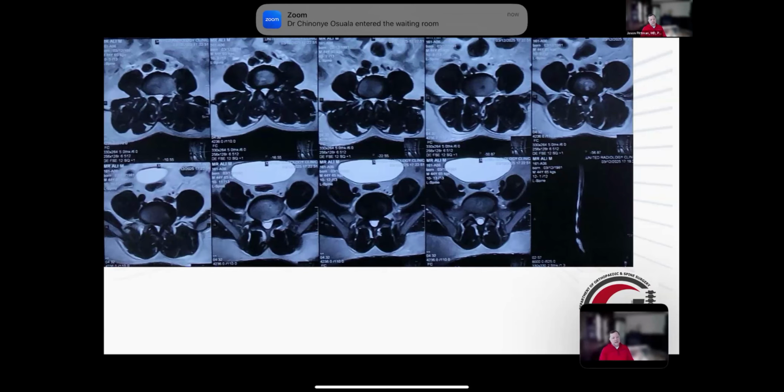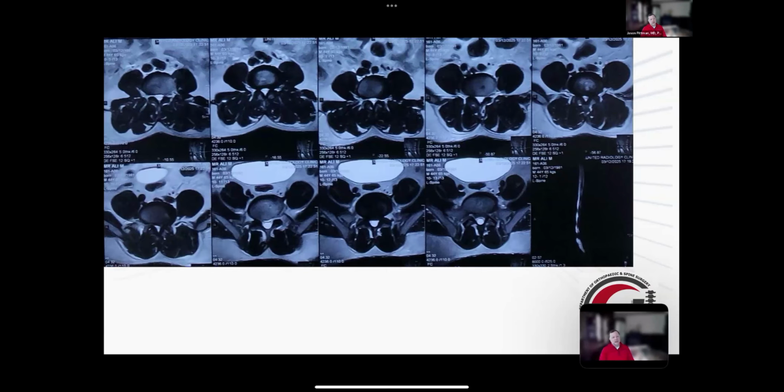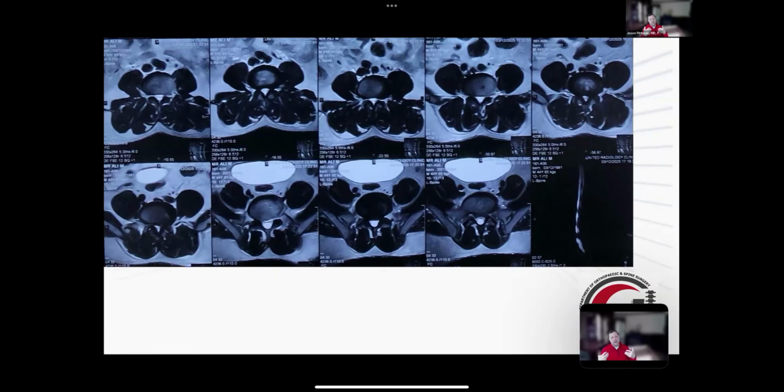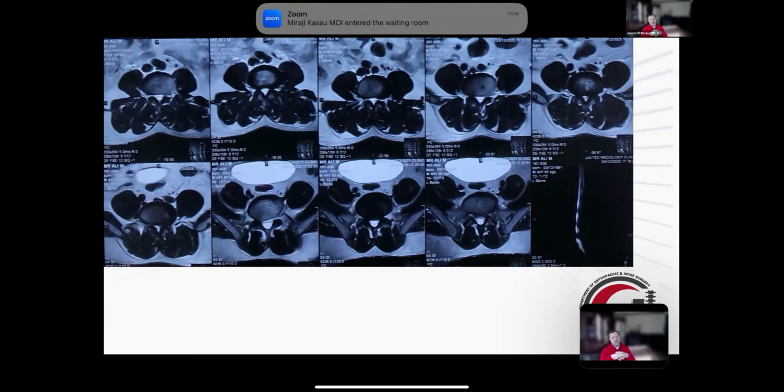The advantage of endoscopic techniques over, say, an open midline laminectomy is the surgical footprint and not disrupting the paraspinal musculature, which may increase the rate of degeneration because you're denervating part of the paraspinal supports and causing scar tissue, which is going to alter the mechanics of the spine across that segment.